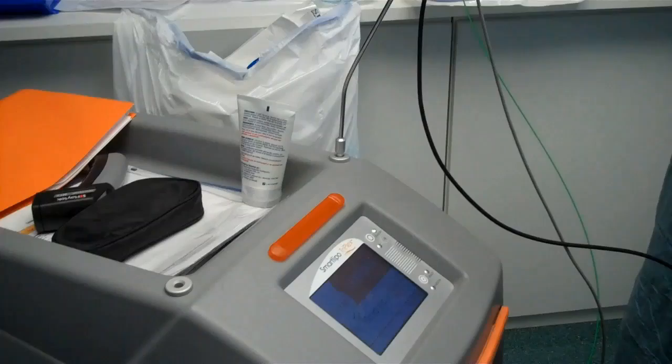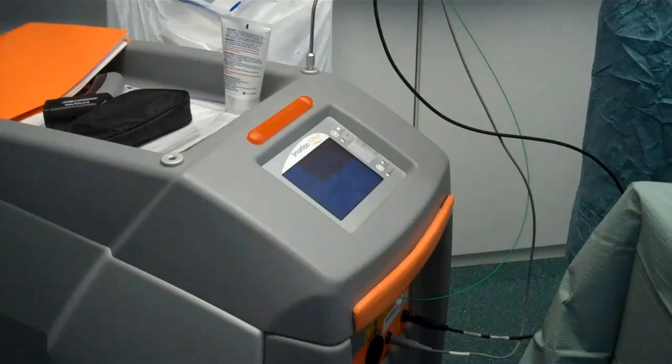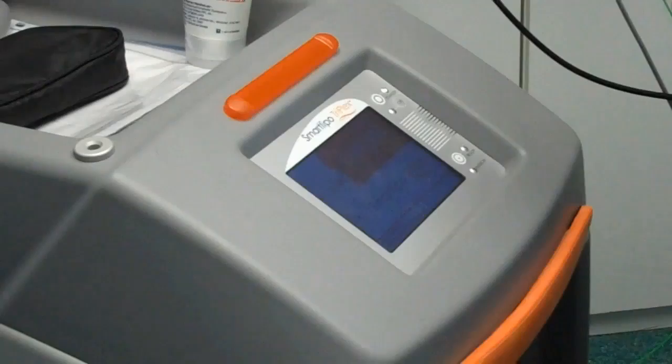We have some safety parameters here. One is a cable to measure the temperature so we don't get too hot on the inside and won't burn the patient. All the controls are done here, and my nurse Nadia will be doing the adjusting as we go.